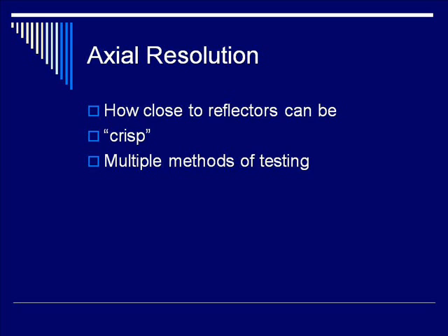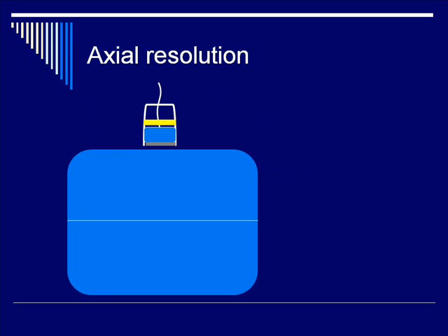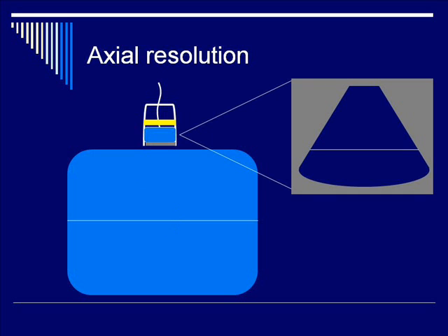Let's start with axial. This is a measure of how close two reflectors can be and still be resolved in the near-field to far-field axis. It's considered a measure of how crisp the image is. This can be tested in multiple ways. The first is to take a phantom with a very thin hyperechoic line and then measure the thickness of this thin line. The thickness of it is the axial resolution because the line is much thinner than you can resolve, so the minimum width it will be given is the resolution.